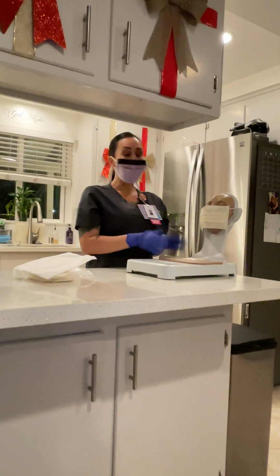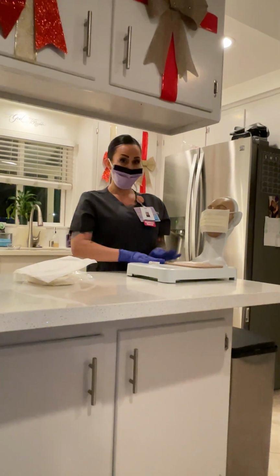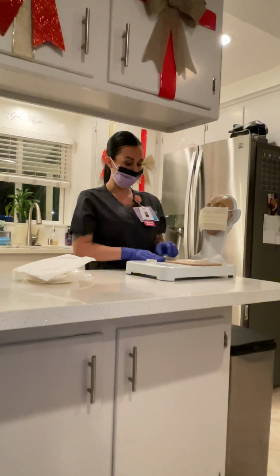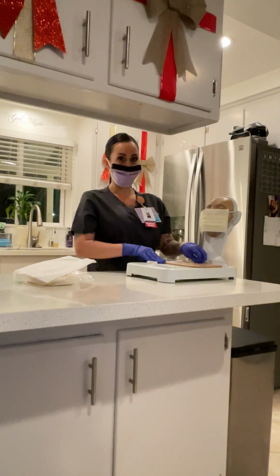I'm going to want to pull the dressing at this time. It's going to be with my non-dominant hand so that I can stabilize the line with my other hand. We want to make sure as well that we pull up on each corner so that we're not tearing too hard.